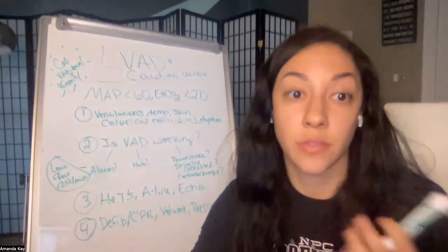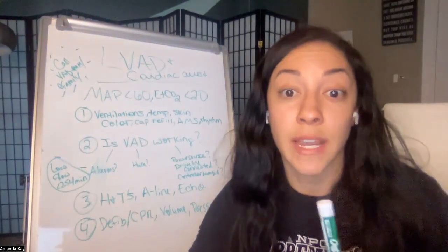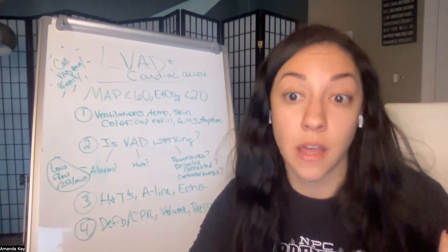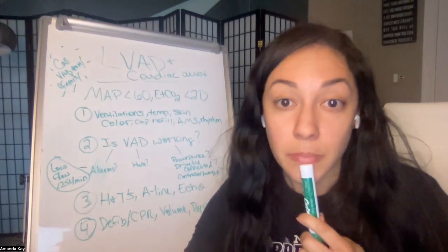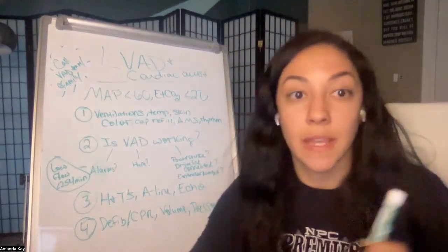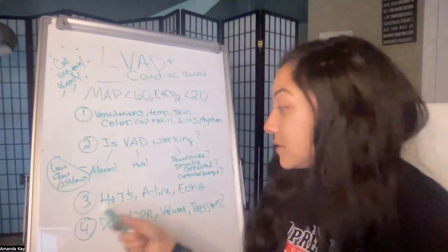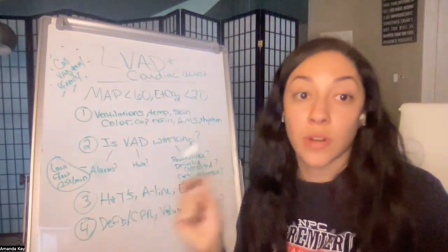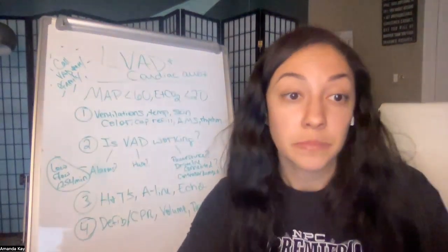While you're trying to treat the other things, such as the hypoxia, hypoglycemia. Did they have a stroke? Is there a giant thrombus in the pump itself? Because that can happen too and cause decreased flow. Infection, bleeding, is there a GI bleed potentially? You know what I mean? Looking at all these things. And then if all else fails, defibrillation if applicable, CPR, getting volume on board, getting blood on board, and even thinking about getting some pressors on board as well. Okay.